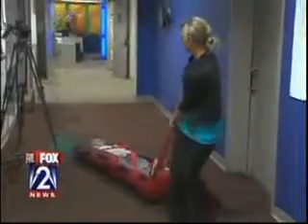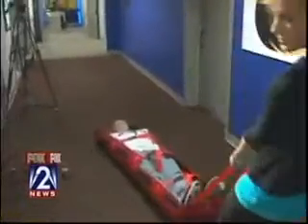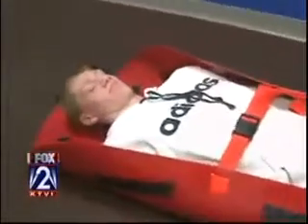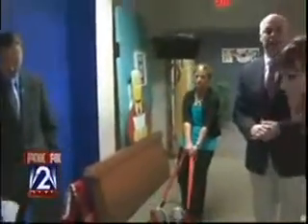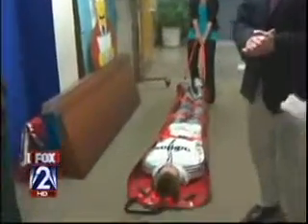Is there a weight limit on this, Clifford, where someone may not be able to do something like this? No. Well, the sled is actually rated at 1,000 pounds. Wow. So it becomes down to a girth size. If you had someone of a very large stature, then we actually move to the bariatrics model, which can carry anybody that you would have in a situation out.